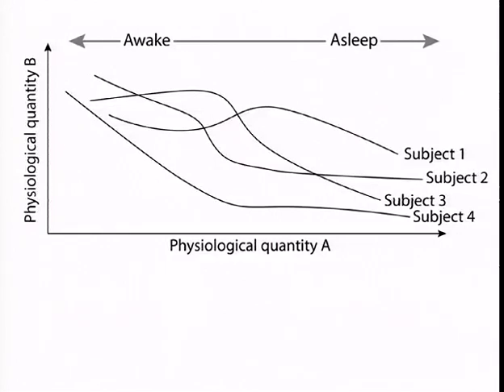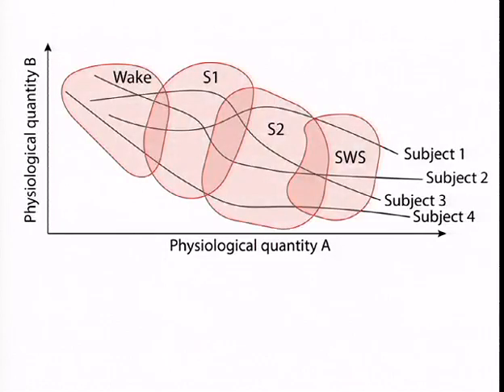So where this picture interacts with our traditional understanding of brain states, at least in the context of sleep, is that traditional sleep staging amounts to classifying regions of this parameter space that might have similar dynamical activity, and then labeling them as one of a small number of these sleep stages. So anywhere in this blob here, you might see EEG activity that's typical of what you might measure in a subject who's awake with their eyes closed, and so on for the other brain states.